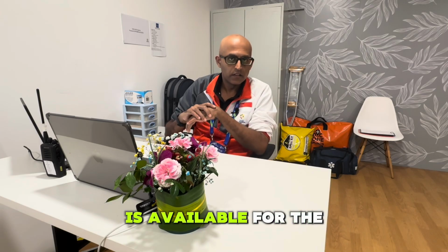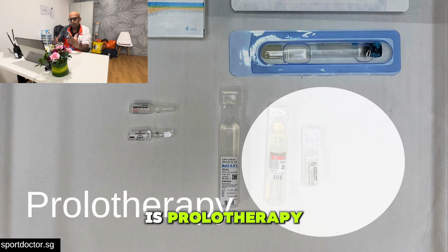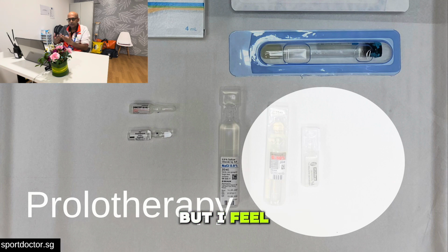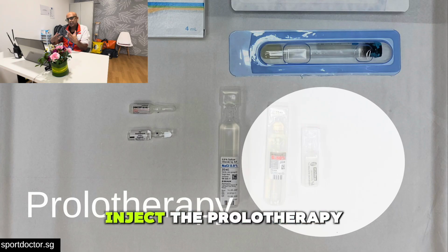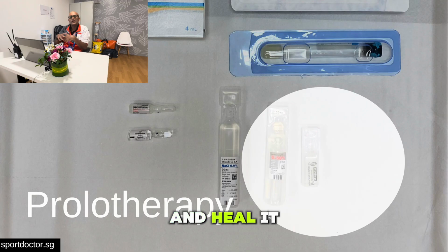Another treatment that's available for the musculoskeletal practitioner using ultrasound guidance is prolotherapy. Now, some people do prolotherapy injections without ultrasound guidance, but I feel personally that it's much more effective if you can see where you're going and be more targeted in your approach. There's various substrates that you can use for prolotherapy, such as glycerin, dextrose with local anesthetic, dextrose alone, or phenol. Essentially, when you inject the prolotherapy into a particular area, you're trying to create an irritation and inflammatory response in that area to stimulate the body to come and heal it.